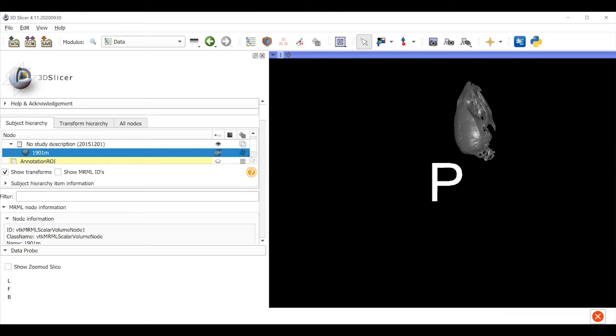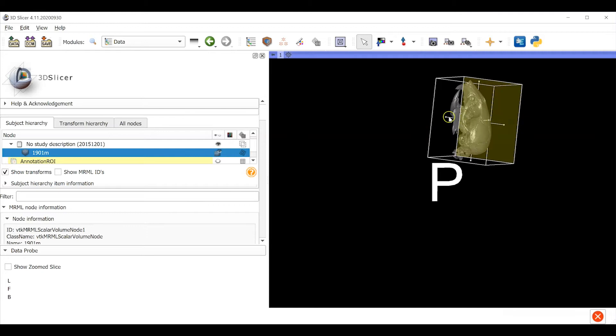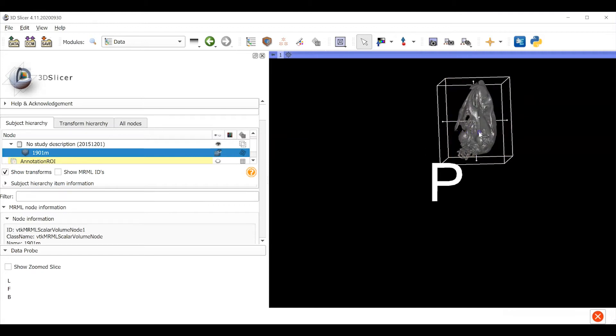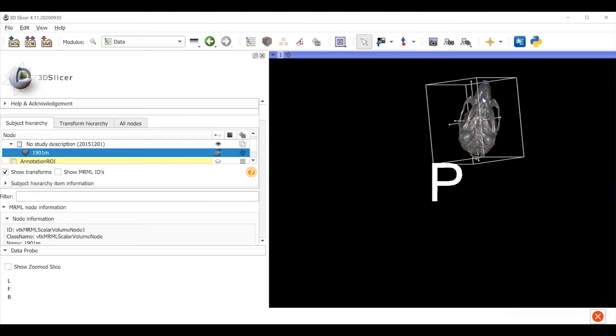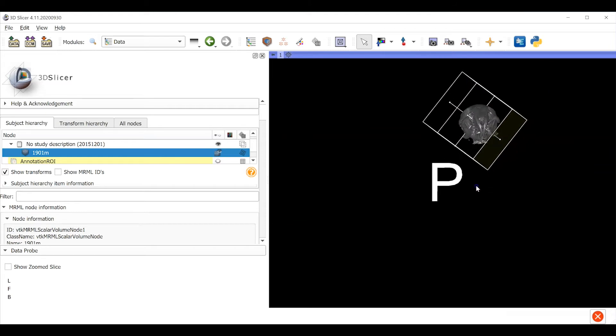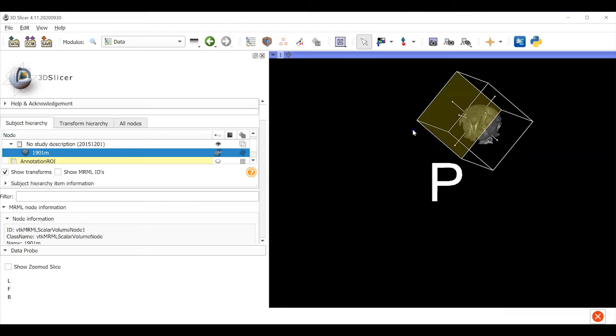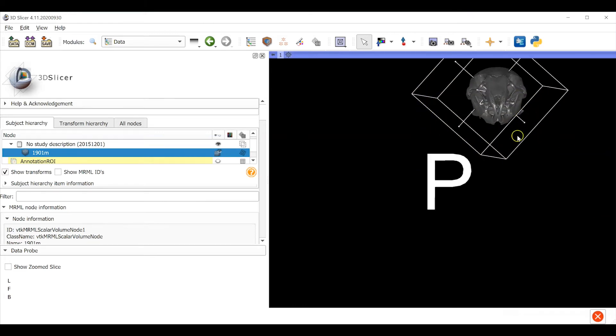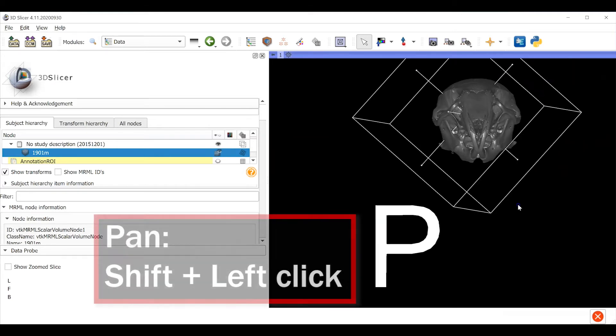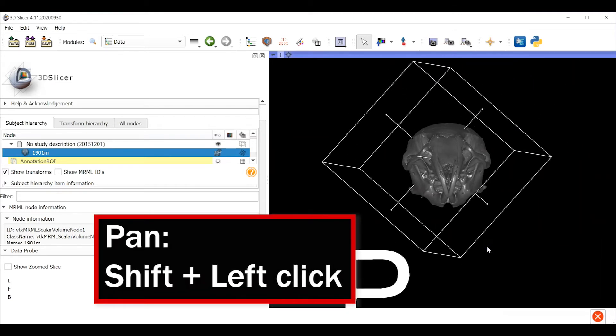When you click in the 3D viewer, you'll know you're grabbing the image volume, because the wall of the volume will turn yellow. Left click and drag to reorient the skull in this space. We're going to rotate the skull using the transform tool so that we're looking at an anterior view. And remember, you can use small circles to rotate the model in the opposite direction. Use the scroll wheel to zoom in the 3D viewer and shift left click and drag lets you pan the image.